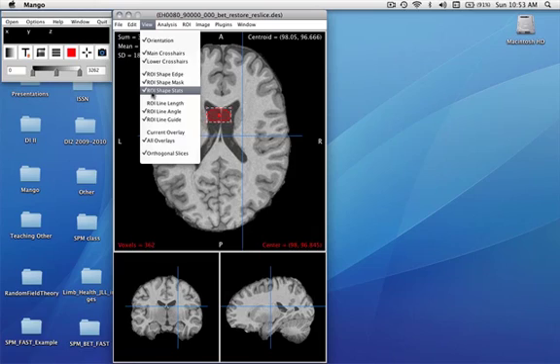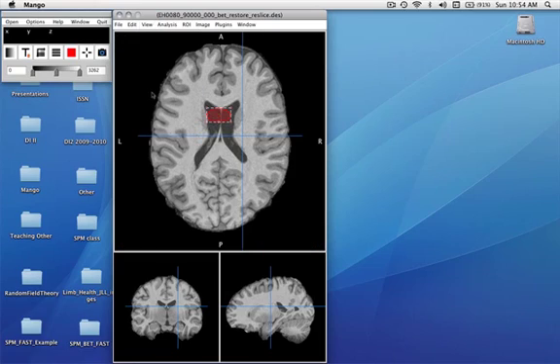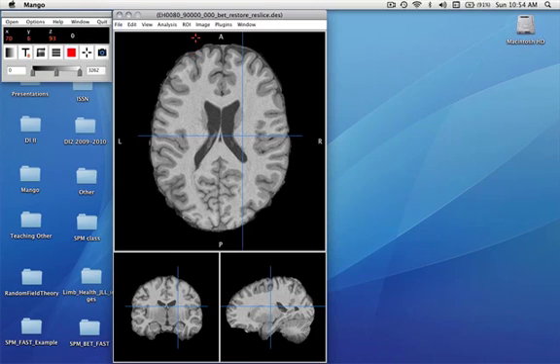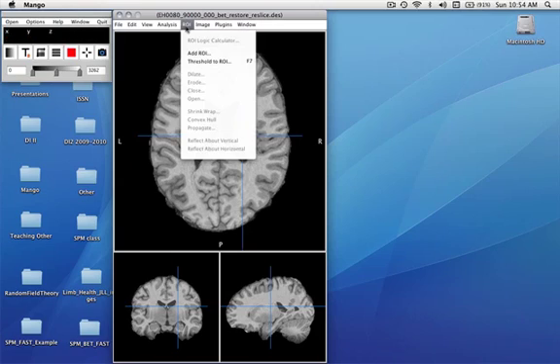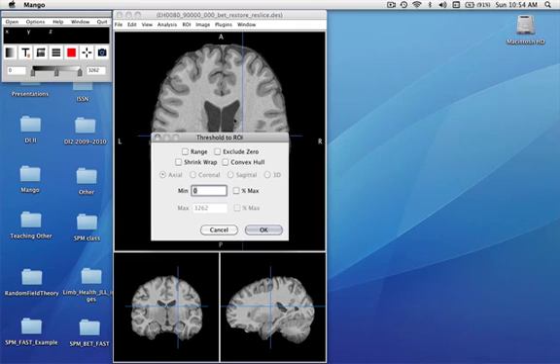Let me turn off the shape stats and remove this small region of interest, and let's look at some of the richer ways of getting at 3D regions of interest. The common approach is to use a threshold. Here we'll use a threshold of 25% of the max.